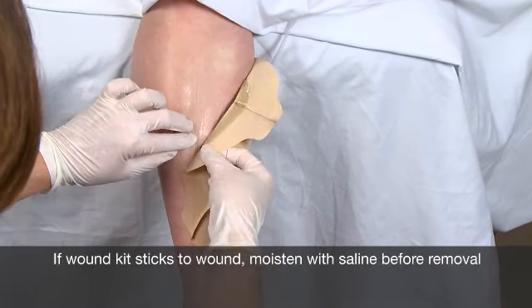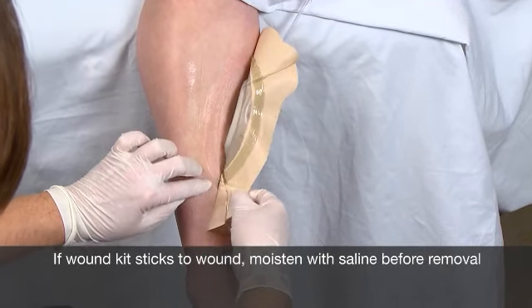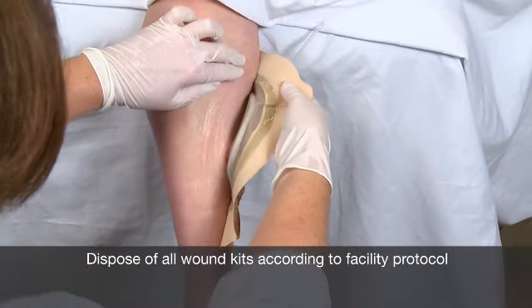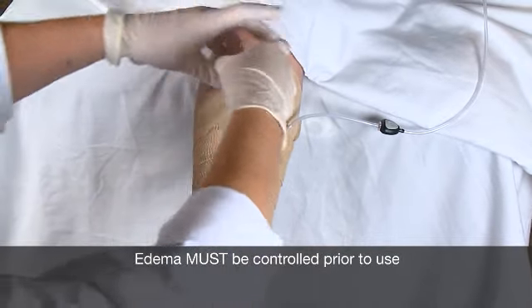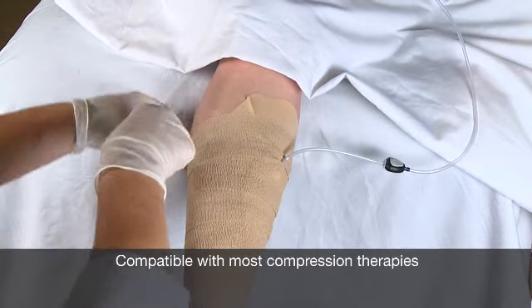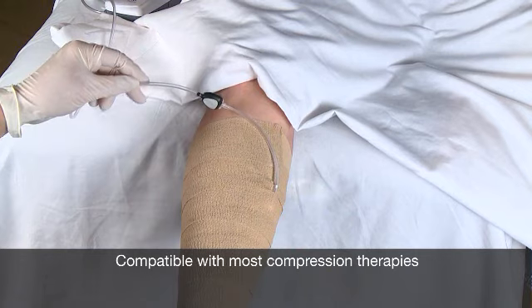If a wound kit is sticking to a wound, moisten the wound kit with saline prior to removal, and of course, dispose of all wound kits according to the facility's protocol. When using a Calypto Medical wound kit on a leg ulcer, edema must be controlled prior to use and kept under control for the duration of the treatment. This system is compatible with various compression wraps, pumps, and stockings.